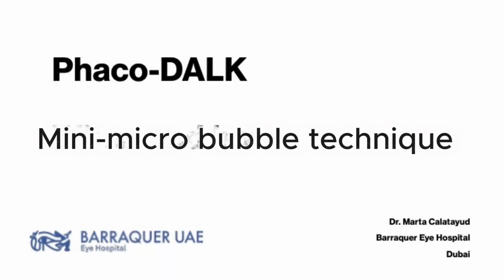We present a case of DALK associated with cataract surgery. Instead of a big bubble, we perform a technique using a mini microbubble to reach Descemet's membrane layer.